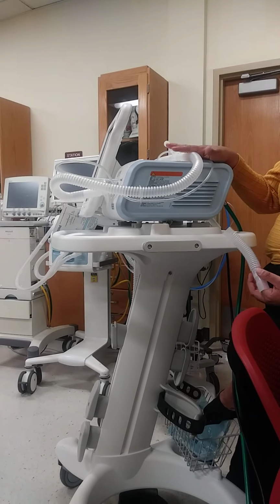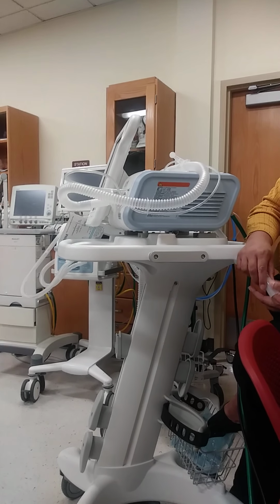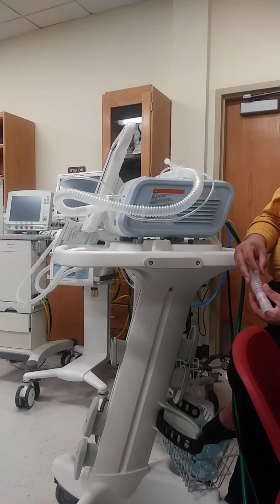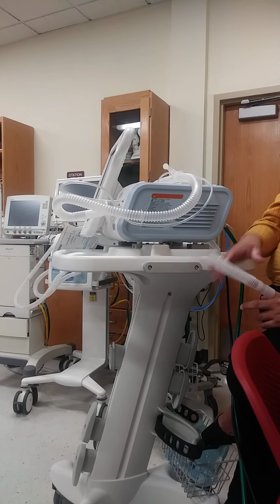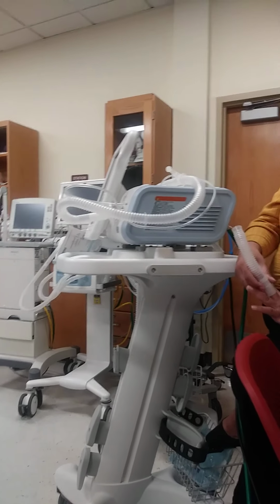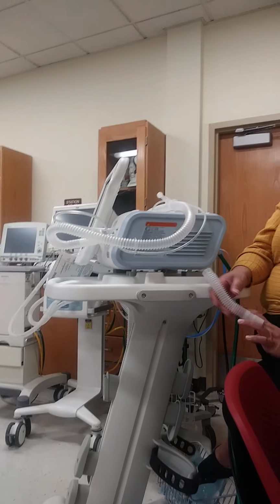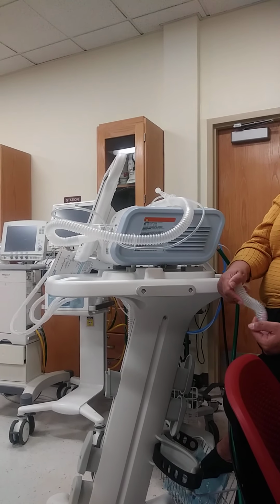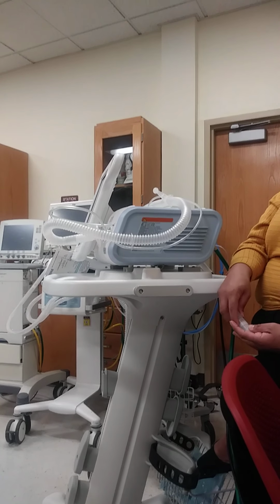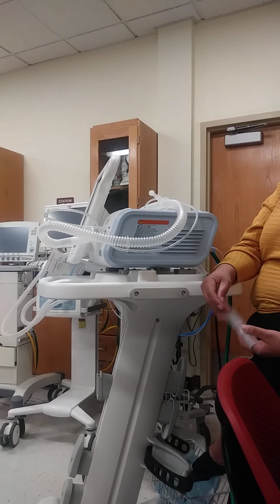If you use this on somebody who has sleep apnea, it's pretty severe sleep apnea. There are some home-use machines that are BiPAPs and are small, just not as detailed as this one. I'll give you an example of people who use BiPAPs for sleep apnea: morbidly obese patients run into issues where they stop breathing at nighttime, apnea.